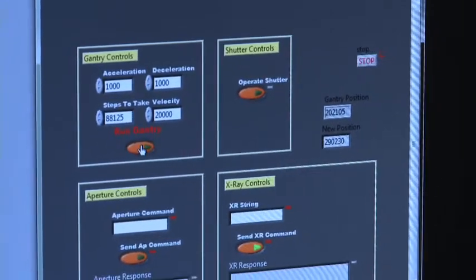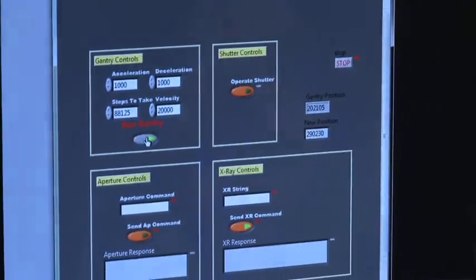What this provides us with scientifically is the ability to monitor the dynamics of radiotracer distribution, which is the wash-in, for example, of a drug into a target area, followed by the washout that occurs as compounds are cleared by the body.